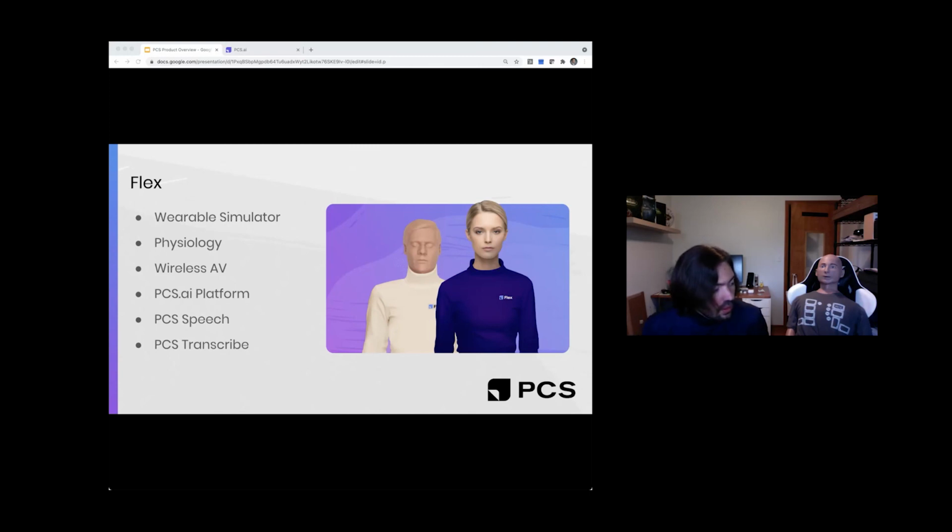How do we clean Flex? Using a laundry machine or something different? Yeah, good question. So the Flex is machine washable. Within the Flex, there are electronics, the wiring harness that controls the pulse points and such. That's easy to remove, and then you can take the Flex, put it in the laundry machine, and wash it in cold water. Included with every Flex is, of course, the washing instructions. So it'll show you how to do all of that.